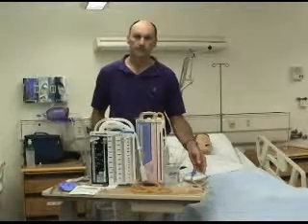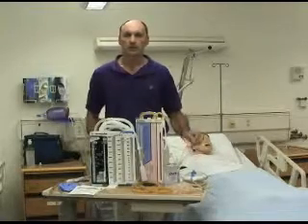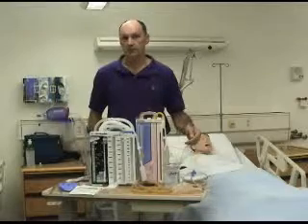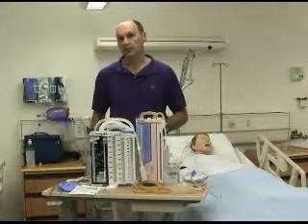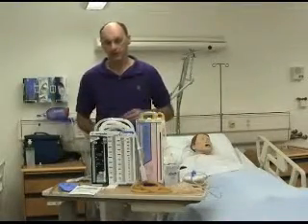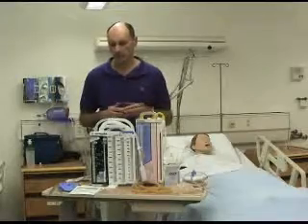to the mannequin in a fashion that will be incorporated into the scenario to increase the realism of the student's experience, and it also helps the student better understand how to manage these systems in real life. In the scenario, I give the case that the patient has had a motor vehicle accident and needed a chest drainage system inserted in the emergency room.